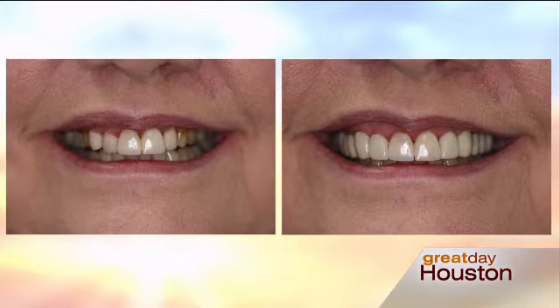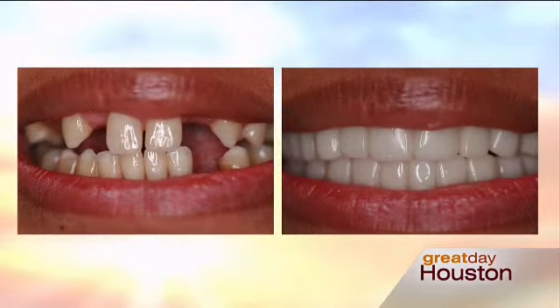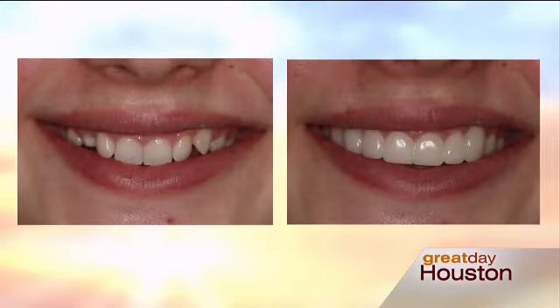There are certain criteria. You want to make sure that your teeth are very, very healthy. If your teeth are flared or you have gum disease, you want to clear that up first. Doesn't mean you can't have it, but even if you have missing teeth, it's actually ideal for missing teeth, but you can't have all your teeth missing. Then you'd need a denture. It's also in place of a partial, and you can also eat with it.